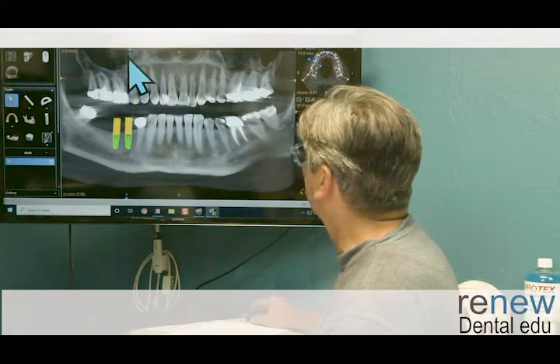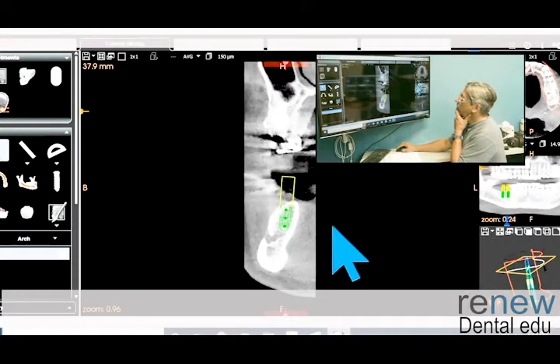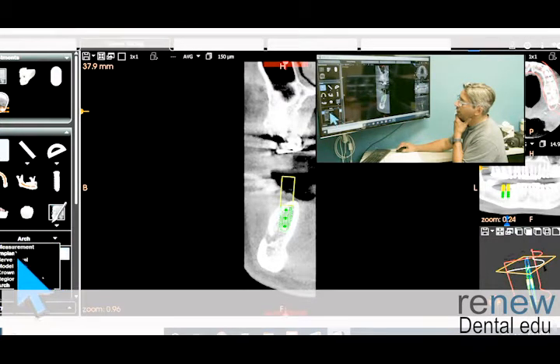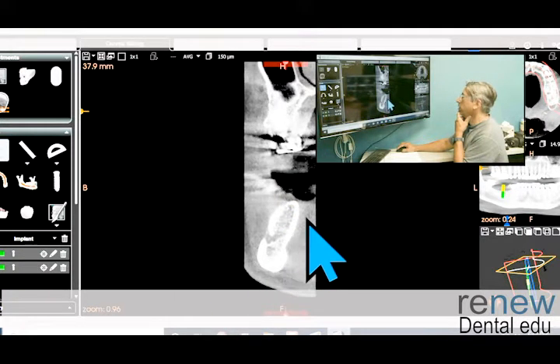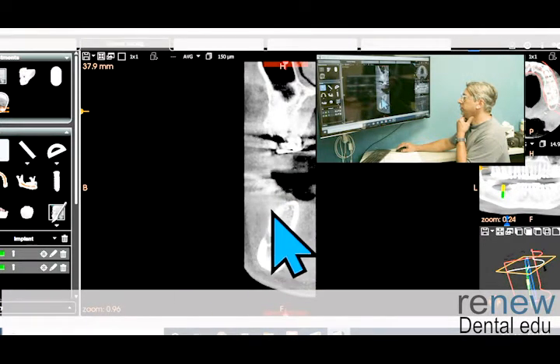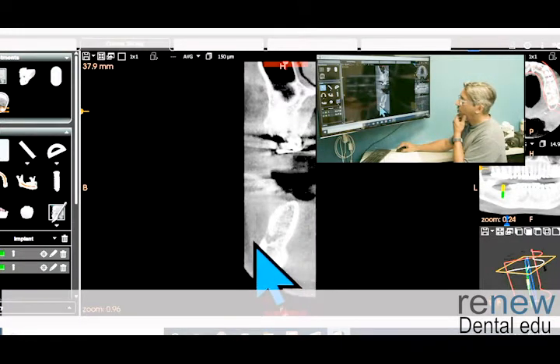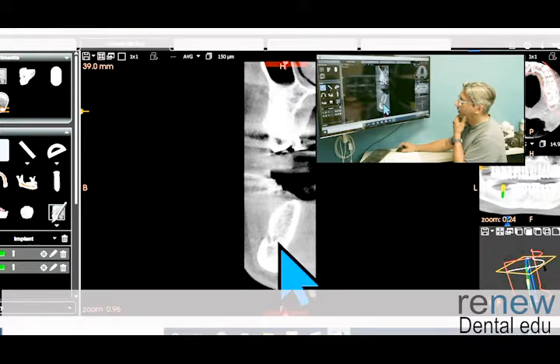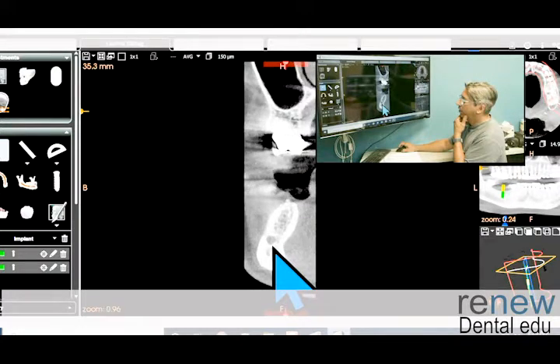If that's the premolar site, we can look closer in on that bone here. Let's go back to the implant area here, and now you can see where the bone is. So he's got a really nice facial plate. It's very nice and rounded. You have a nice hard lingual wall. You clearly see where the nerve actually is. There's a foramen going through, and it doesn't really go any higher than that. It actually goes pretty well down. So you have a decent amount of bone.